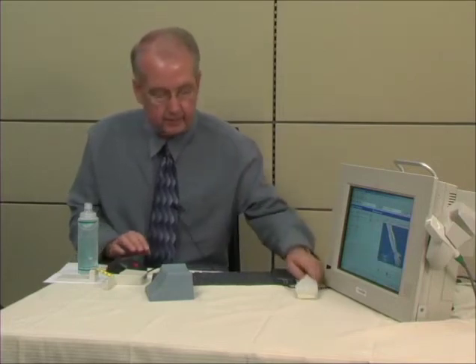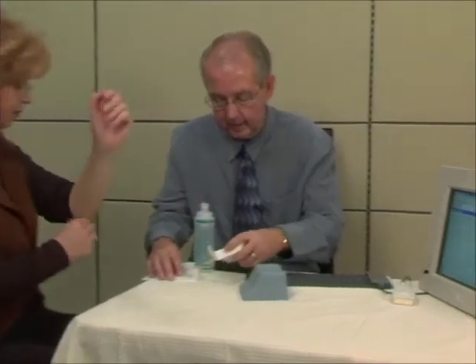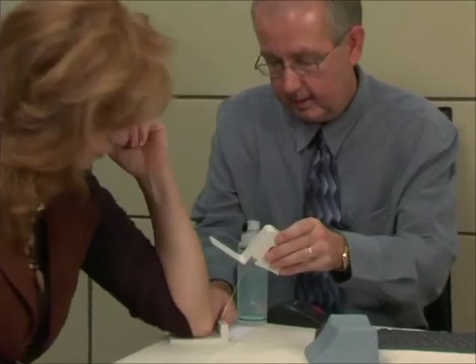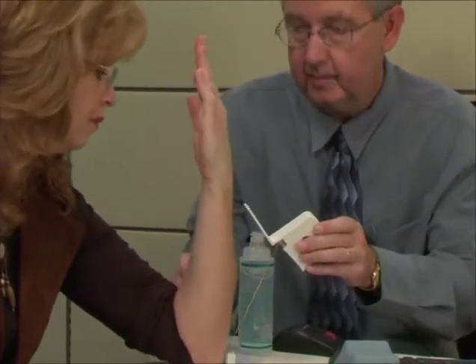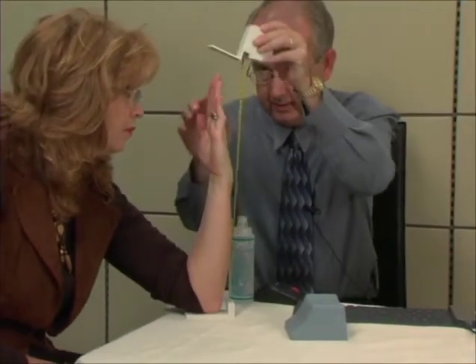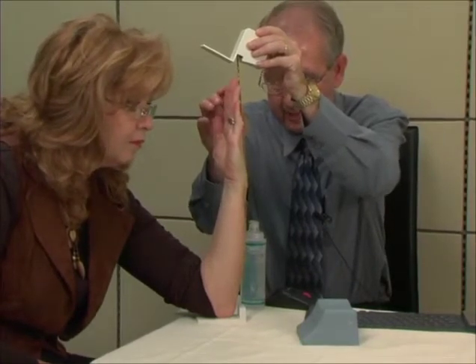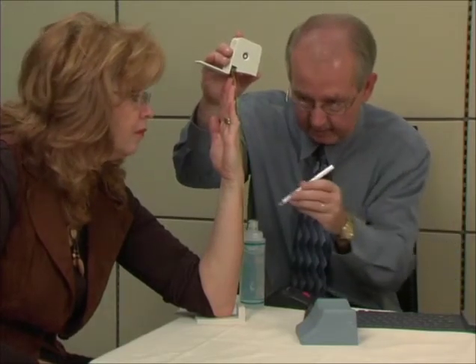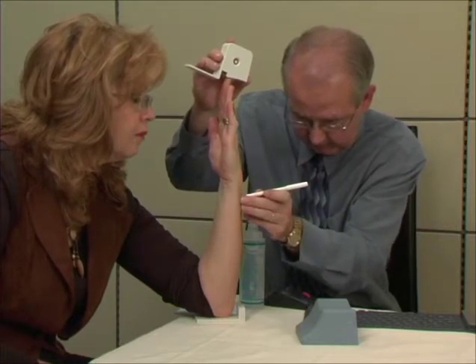So what I need to do first, Mrs. Smith, is measure the length of your arm. We have a handy measuring device here. If you'll just put your elbow into this right up square with the edge of this device and extend your arm out, and with the tip of your finger as high as it'll go, I'm going to measure with this device to the very tip of your finger. And I see that it's 45 centimeters. So I'm going to take my marking pencil and take half of that because that's where we want to measure. So at 22.5 centimeters, I'm going to put a small mark.